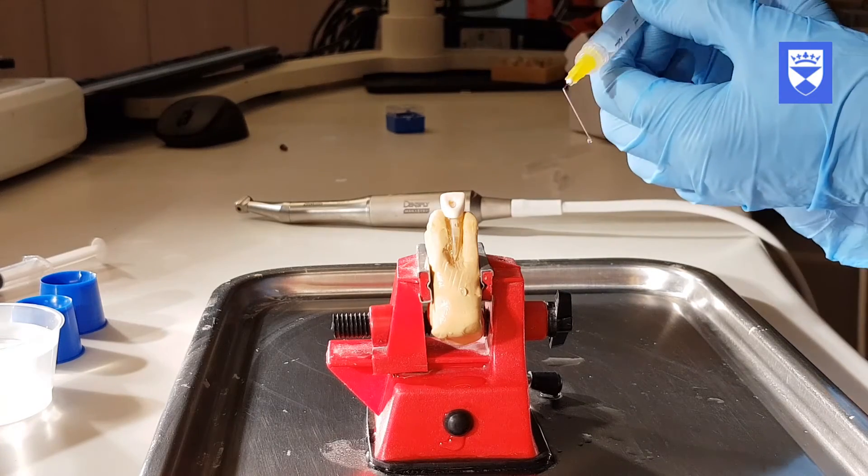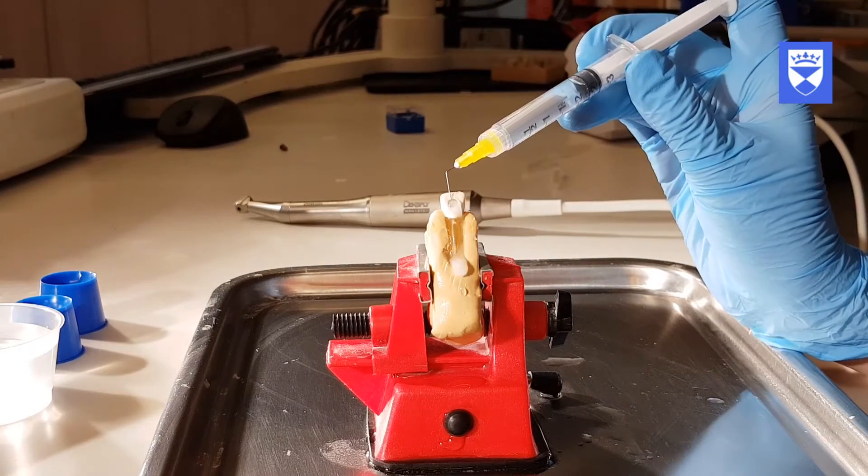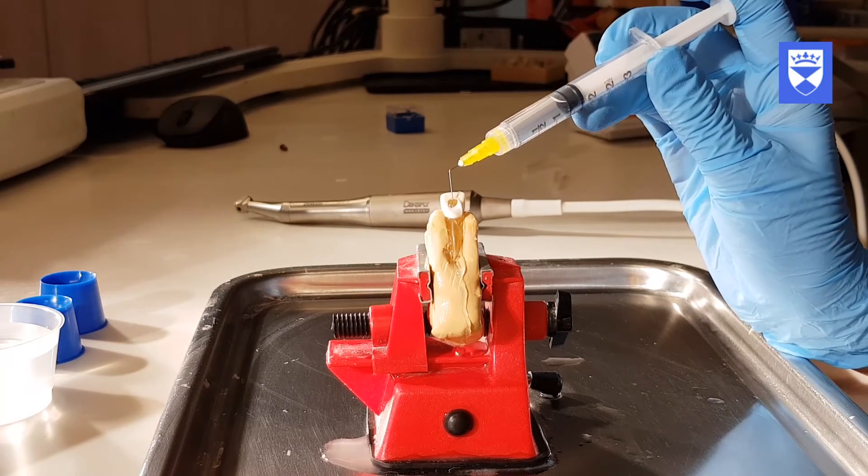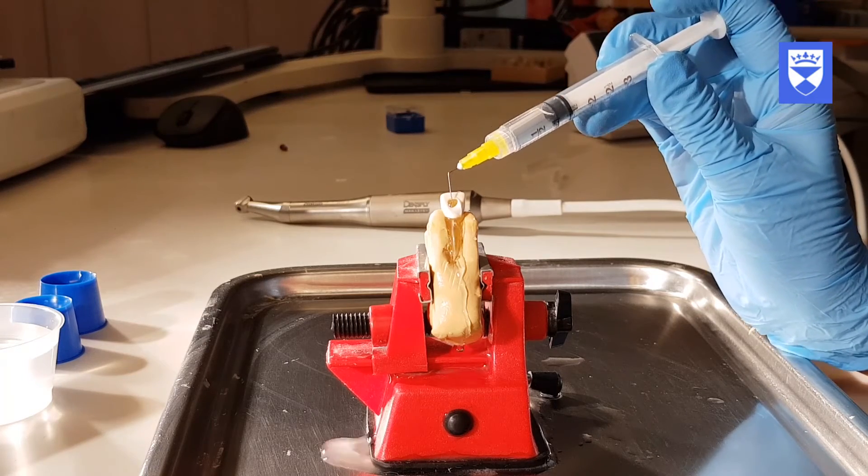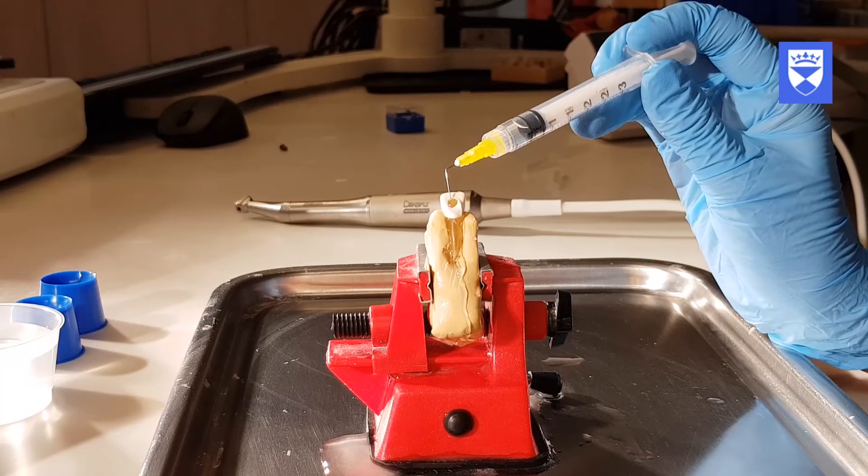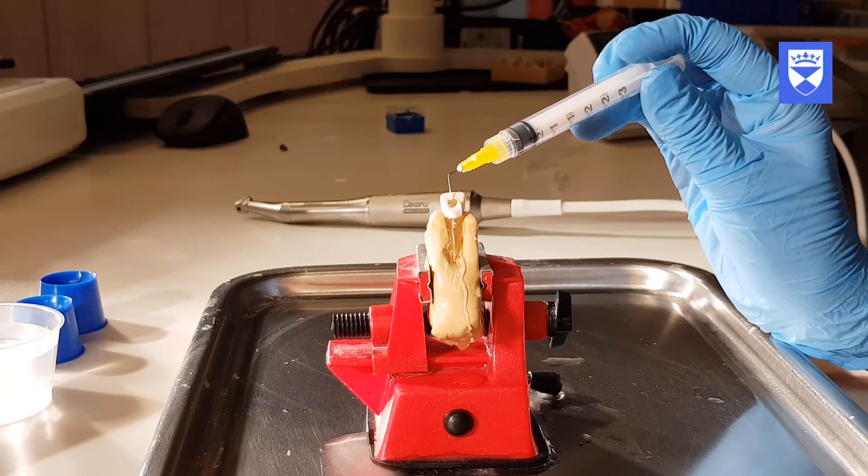Once the canal has been finished, the final irrigation should be completed. The final irrigation sequence is as follows: 3ml sodium hypochlorite solution, followed by 3ml citric acid solution, and a final 3ml sodium hypochlorite solution.